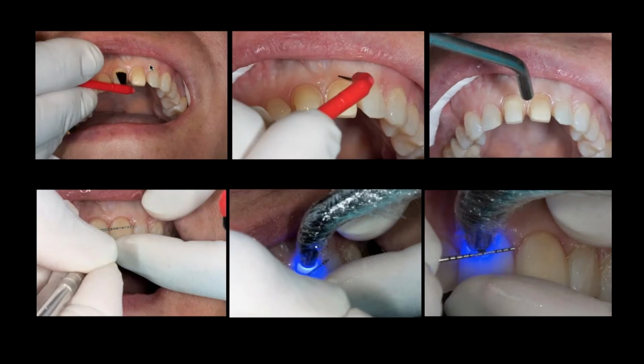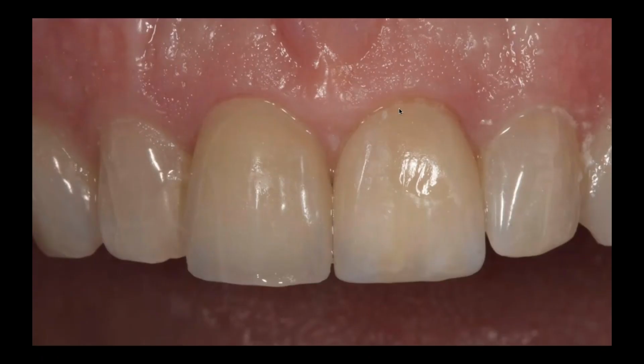So we clean up everything, use a sealer, bonding agent, whatever the doc does, dries it. Here you have this depth finder, and you hold the veneers while you just tack them on. That way they don't move. And then we go ahead and finalize the cure. And these are supragingival. There's still a little cement that needs to be cleaned up here, but I had to get out of there. But they look really nice.